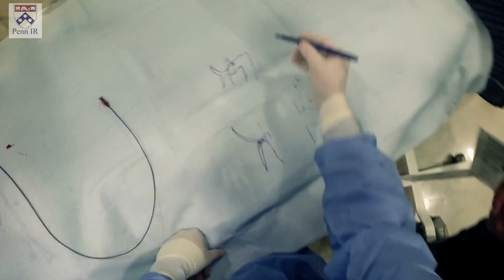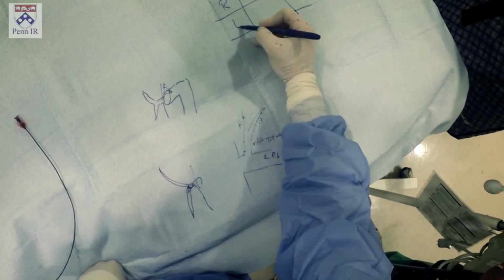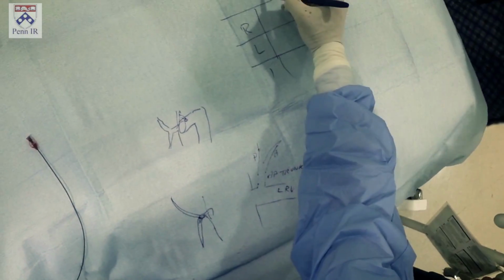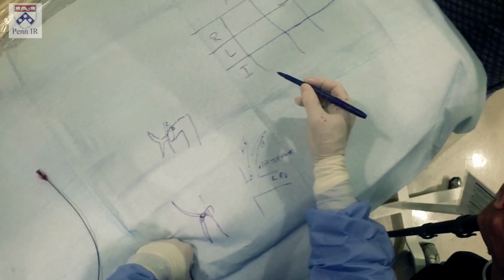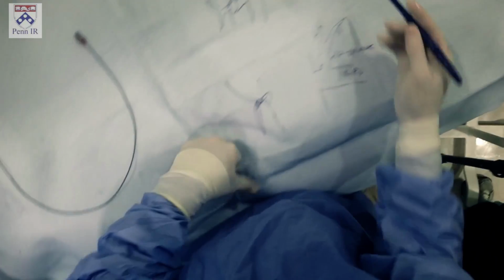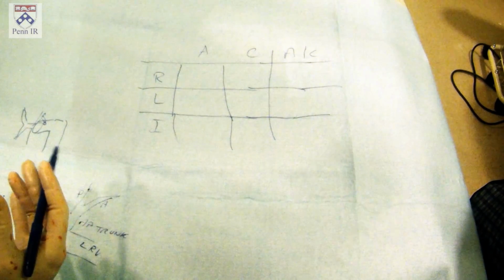So we're measuring aldosterone and cortisol to the right, left, and then the IVC, and then we're going to measure an AC ratio. The first thing we're going to do is, the cortisol is a dual control. The first control is to make sure that you actually were selected, because again, the appearance of the right adrenal vein is very variable, so you don't really know that you're in it until you get the blood back, which is then too late, right?